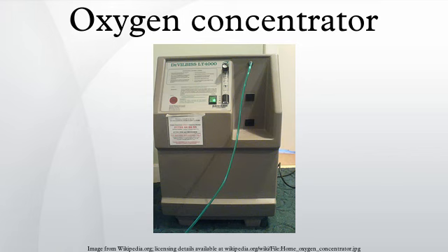However, applying the oxygen generator nomenclature can lead to confusion. The term oxygen generator is a misnomer in that the oxygen is not generated as it is with a chemical oxygen generator, but rather it is concentrated from the air. The use of the oxygen generator terminology can also be a problem in shipping in the wake of the crash of ValuJet Flight 592, which crashed due to a fire caused by chemical oxygen generators.